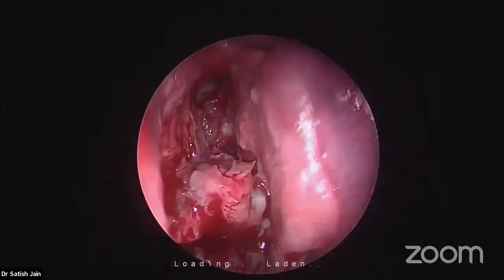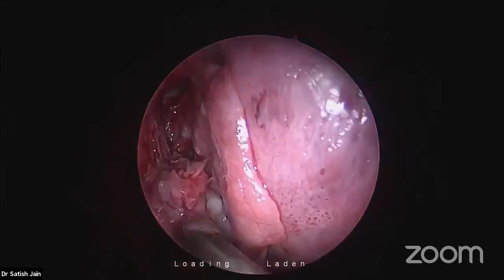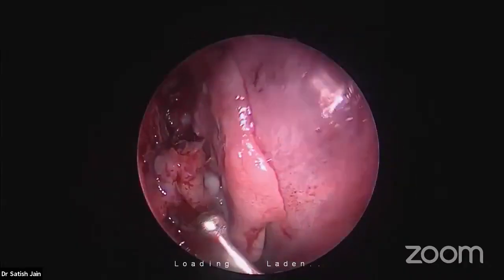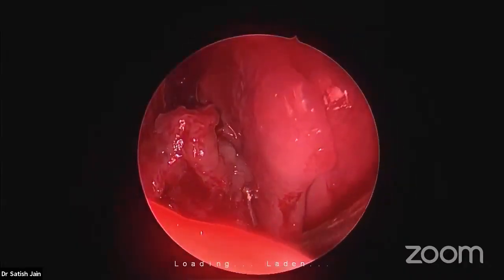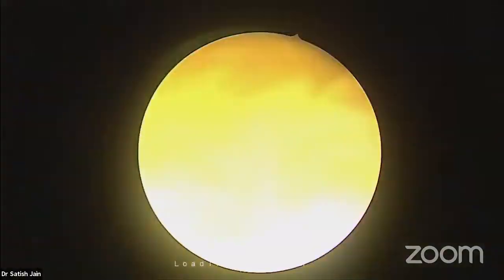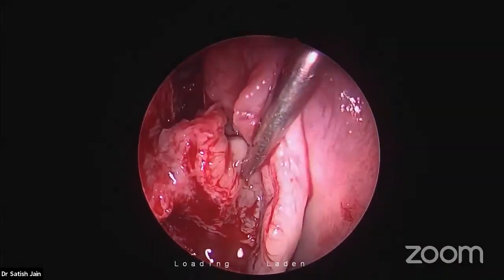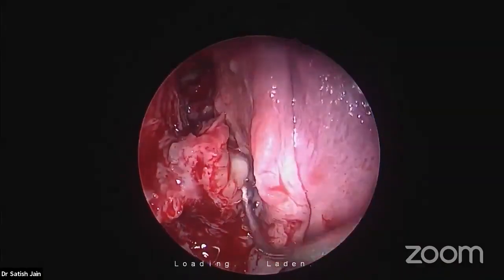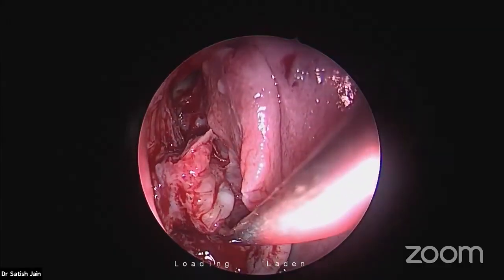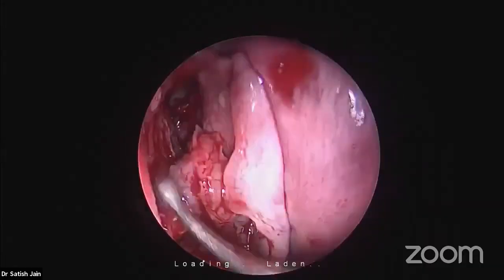And the other fissure is between, look, this bulla and the middle turbinate. See this space. Can you see this space? This is hiatus semilunaris superioris, and this leads to the retrobullar recess. And I can go behind and fracture the bulla completely anteriorly now.